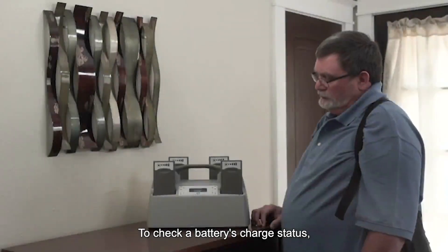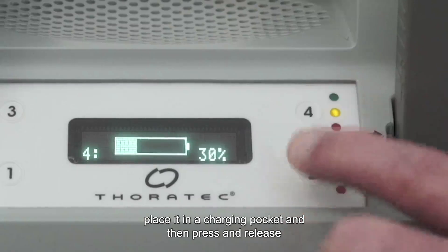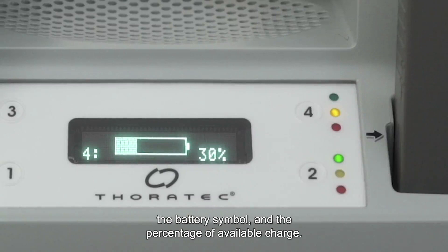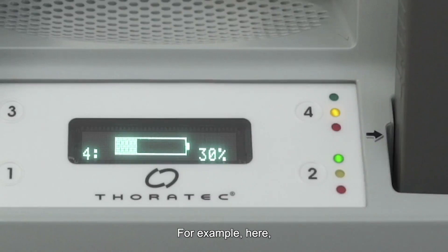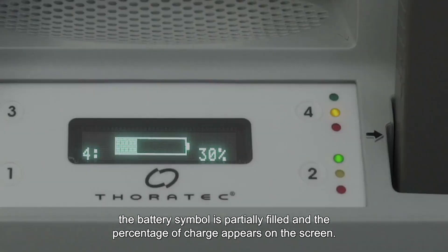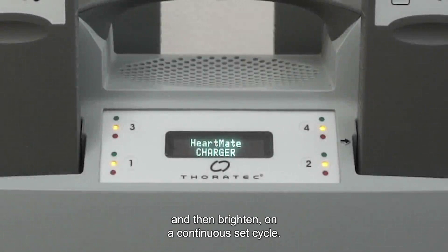To check a battery's charge status, place it in a charging pocket and then press and release the number button for that pocket. The display panel shows the pocket number, the battery symbol, and the percentage of available charge. For example, the battery symbol is partially filled and the percentage of charge appears on the screen. Be aware that it is normal for the display screen to dim and then brighten on a continuous set cycle.